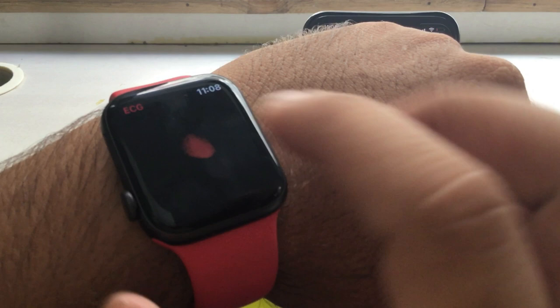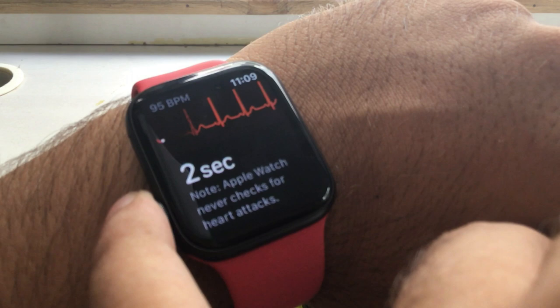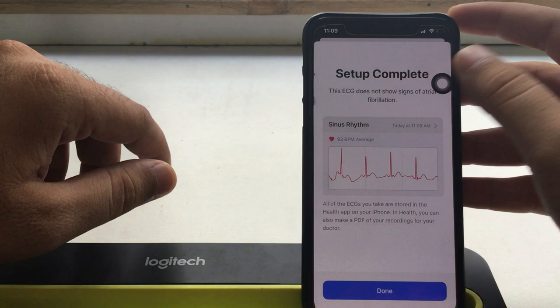Take your first ECG test on your Apple Watch and wait for the completed 30 seconds. When it's completed, you will be notified on your iPhone with a notification or you can open the health app on your iPhone to check the result. Now tap on done to save it to your iPhone health app.